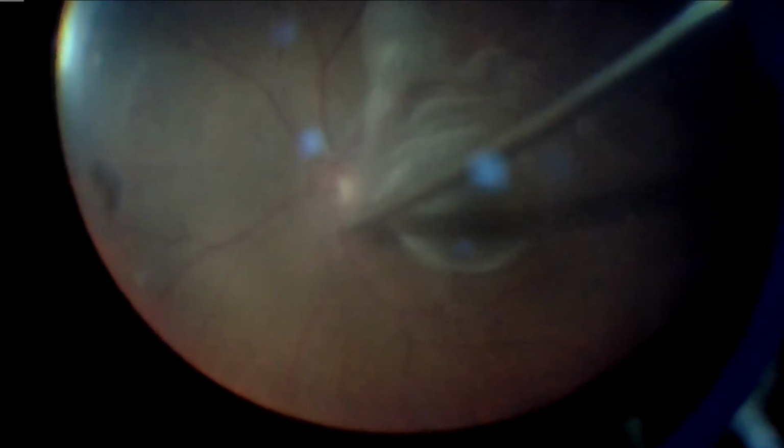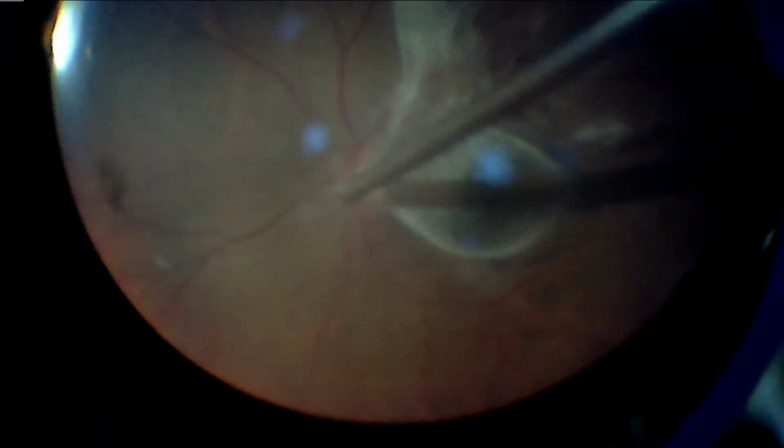It's very important to create a PVD in these cases, as if PVD is not created, later on macular pucker and ERM forms because of the cortical vitreous. So we can see the PVD has been created and now the retinal surface is bare with no cortical vitreous.